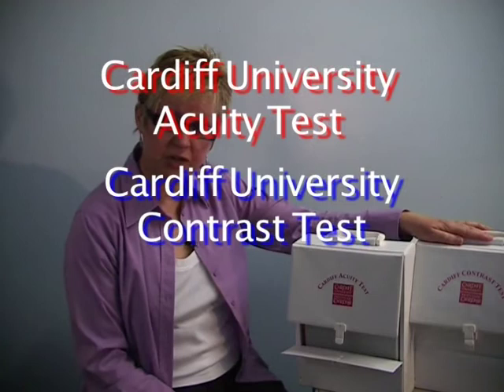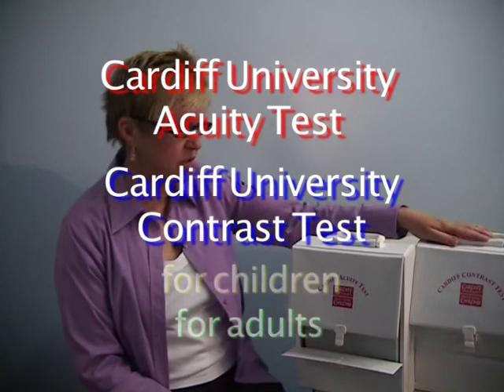We have a Cardiff acuity test and a Cardiff contrast test designed for children, and we also have adult versions of both tests.